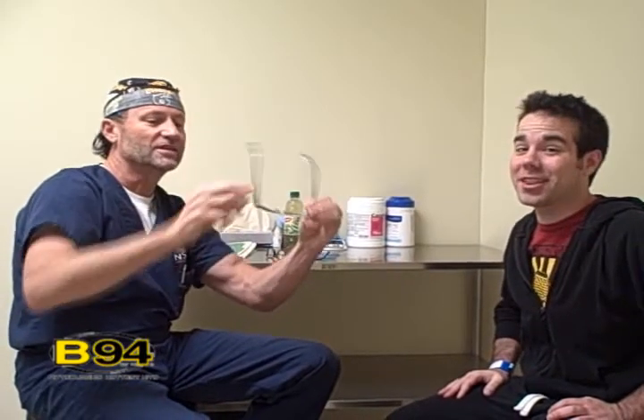Well, first of all we're going to take those glasses off and just get rid of them. He is more than just a little bit nearsighted, so we're about to change your life.